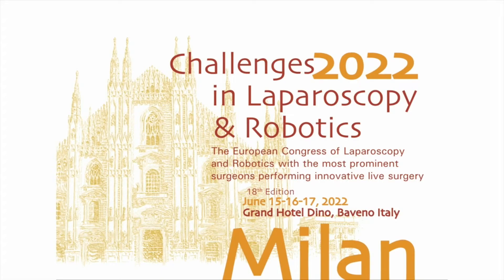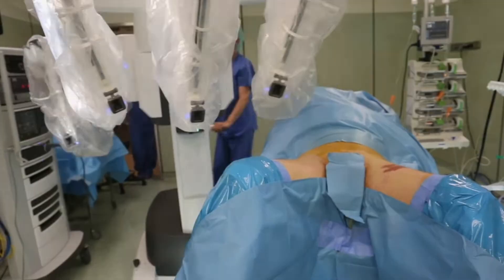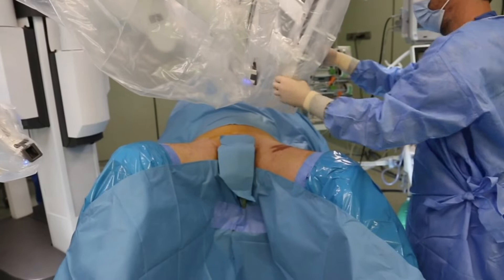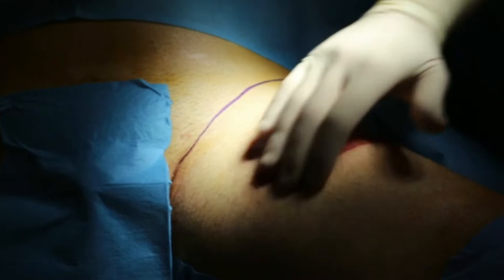I'm going to present a modified robotic inguinal lymphadenectomy. I will explain more about the case later, but now I will start to show you patient positioning. The patient's position is completely the same as we do for robotic radical prostatectomy using this boot-leg holder. It's very important once you have placed the patient like this to flex the knee a little bit more in order to have the limb completely parallel to the floor. In this surgery I'm using the Xi system, so I have to place the patient cart on the left and the right side of the patient in order to go to the left side. Keep in mind this scar that you can see on the left limb - I will explain later why it is there.